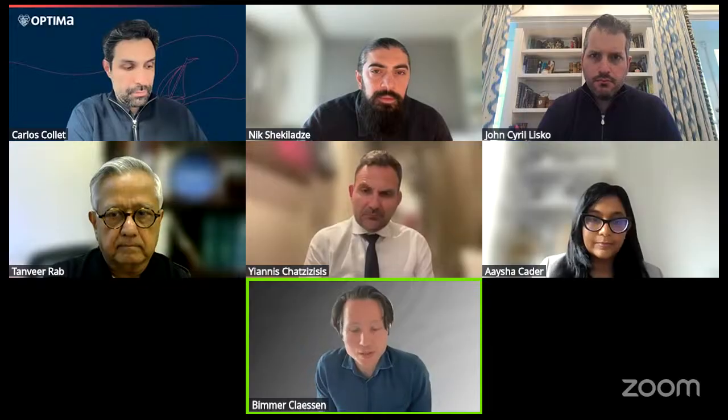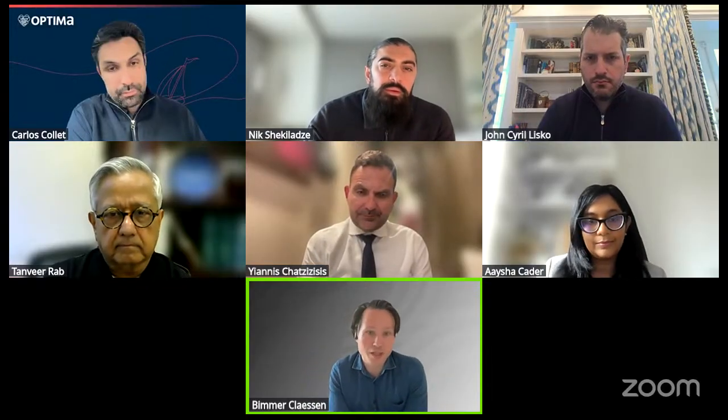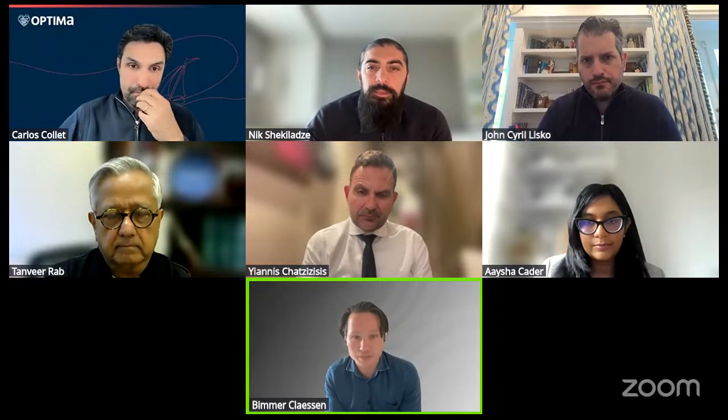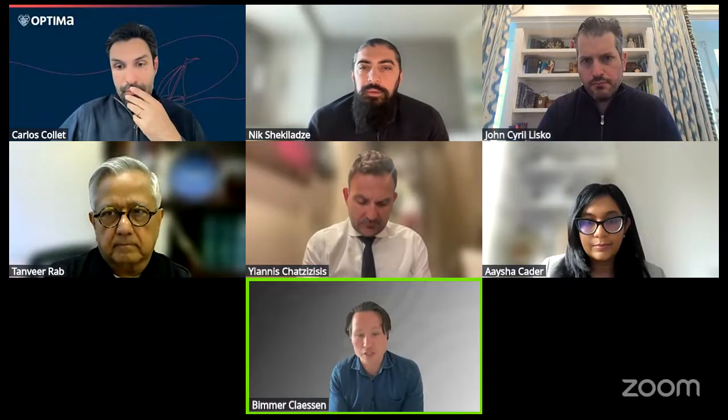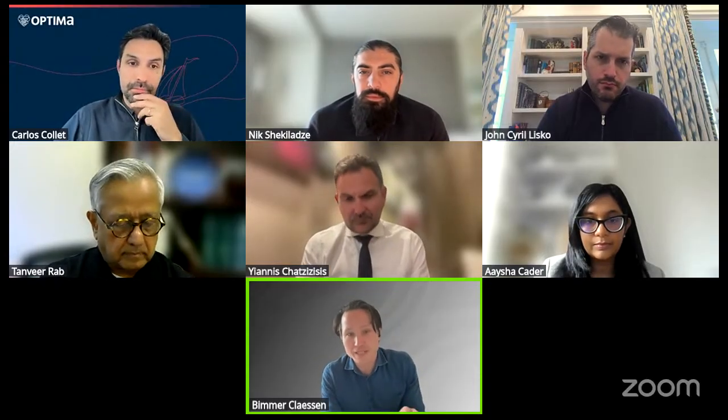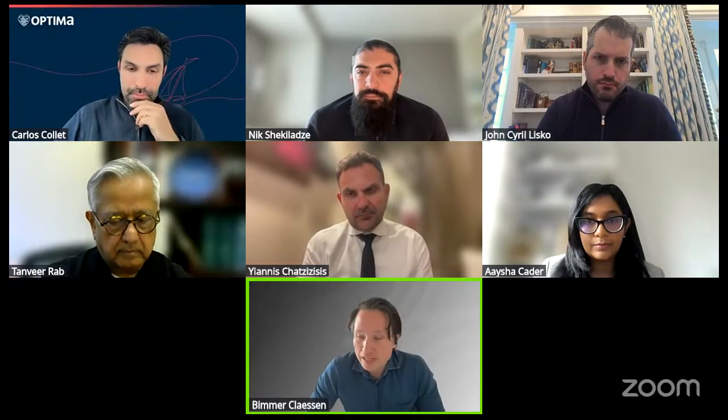Carlos, if I could ask you a question too. We've been using a lot of CT as well in the Netherlands, and I agree with you that it's an amazing technology because it gives you the complete three-dimensional anatomical information, not just the luminogram we get with coronary angiography, but also information about the plaque itself. In my experience, the negative predictive value is extremely high, but the positive predictive value can be a little disappointing at times, when there is a lot of disease on the CT, but you take the patient to the lab and it's still relatively moderate.